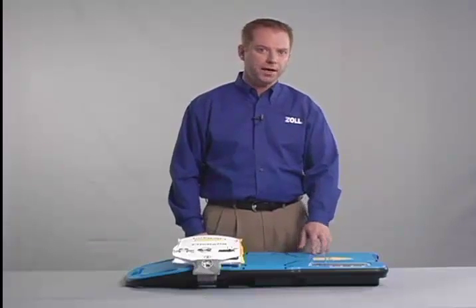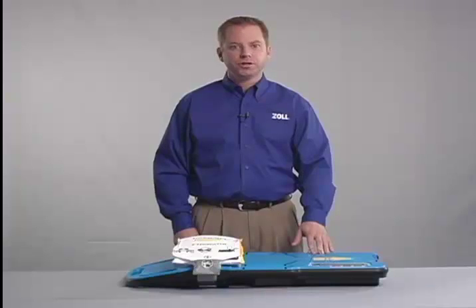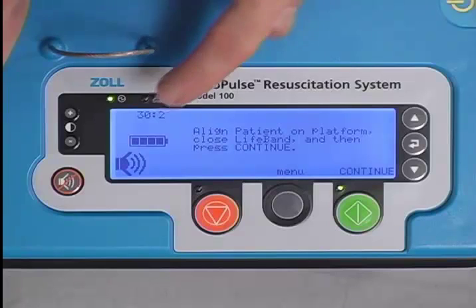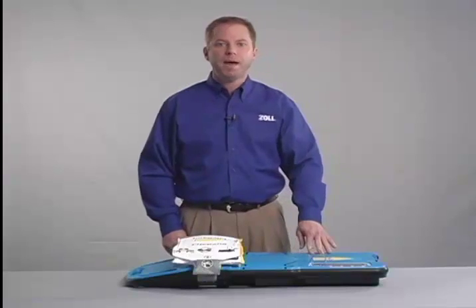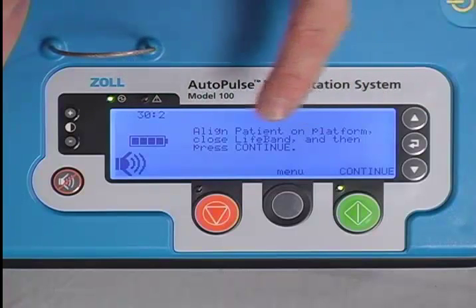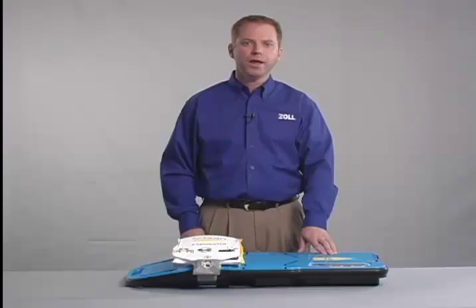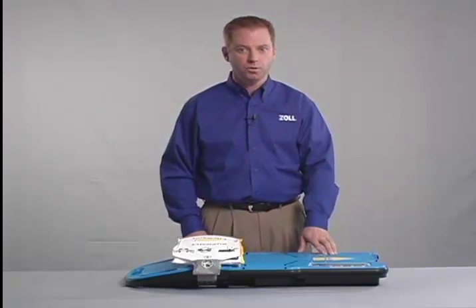The user control panel includes the user display, which is an LCD screen on which instructions and other information are shown. The light-dark contrast for the screen can be adjusted with the contrast buttons. The green power LED is lit whenever the Autopulse is powered on and able to respond to user input. The red alert LED makes the user aware of a condition that requires attention. When the red alert LED is lit, further information and instructions are shown on the user display.